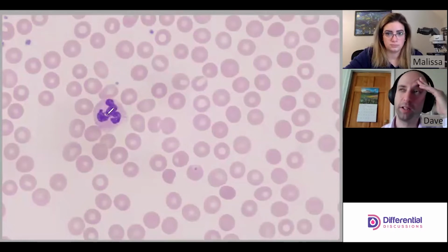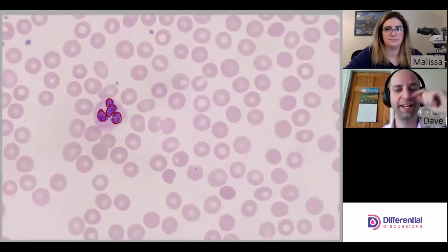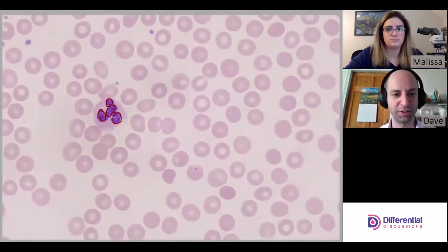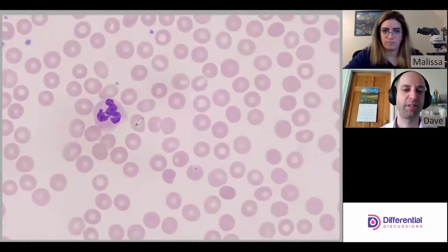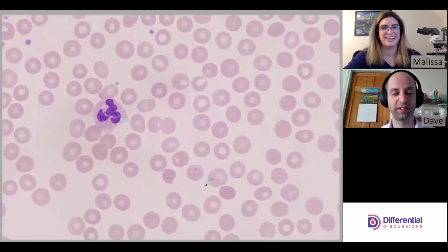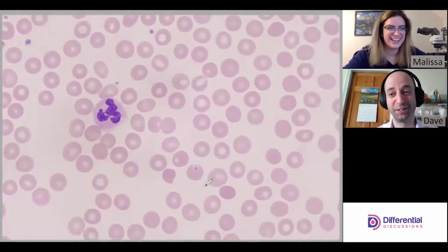Depending on the nomenclature someone may use, they might call it a polymorphonuclear neutrophil, though no one says this anymore, right? That's lending to the lobed segmentation of the nucleus. I just outlined that there are 4 here. Counting lobes will become important later on in your career, once you're past normals, past lymph and neutrophil.